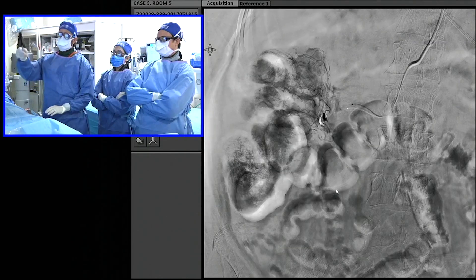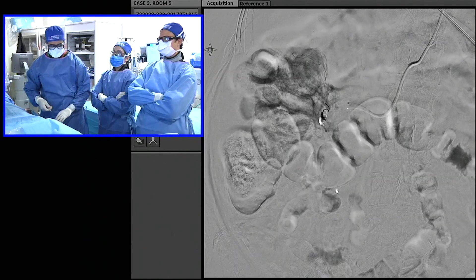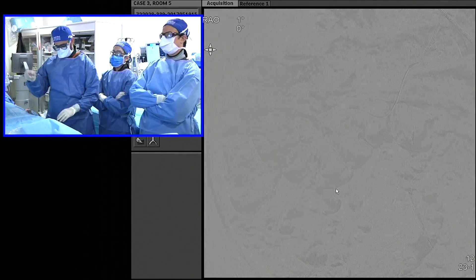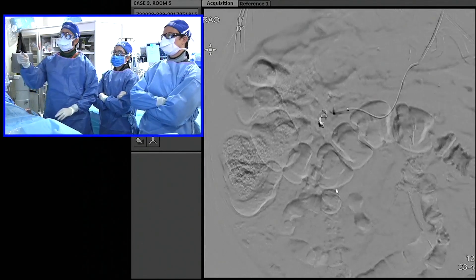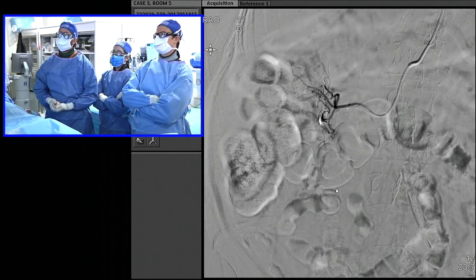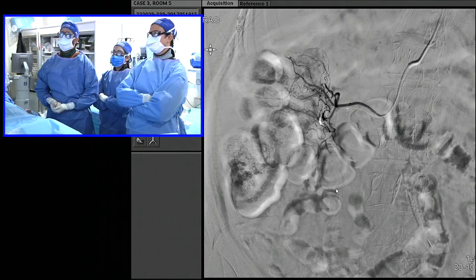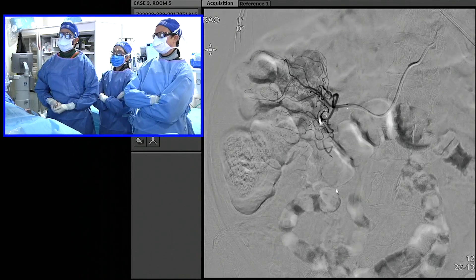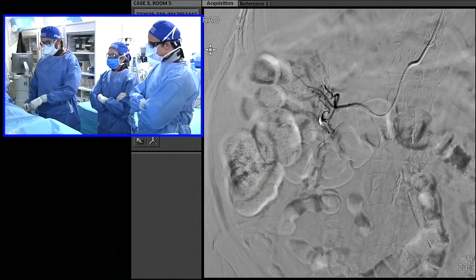I think that's pretty good. Unfortunately there's a little bit of overlap there because the colon sort of makes a loop there. But the vessel that we put the coil in is actually out — occluded.